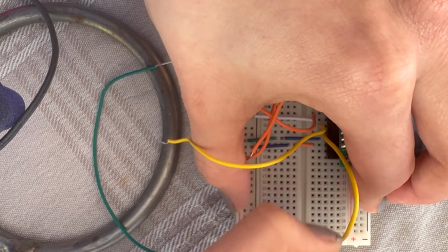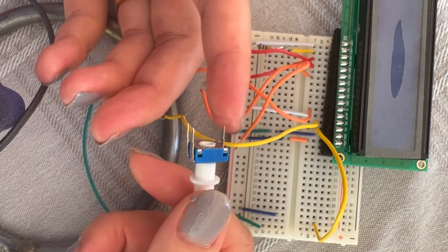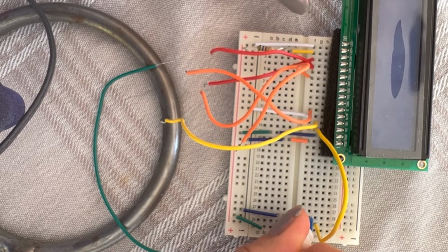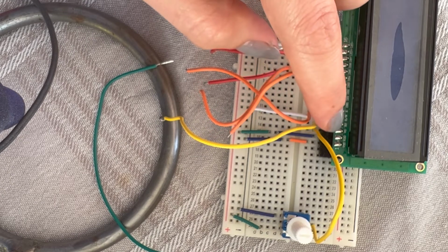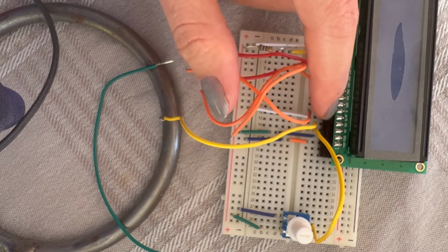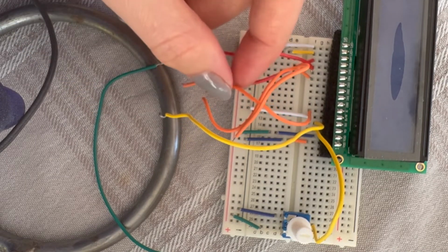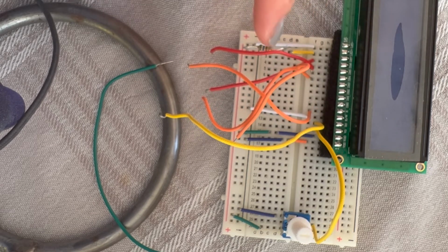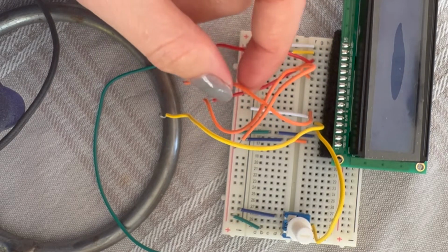Let me show this. It has 3 legs, as all other sensors. These 2 legs, either of them, you connect to plus and negative, I mean ground and plus, and then the third leg is connected to the one which says V0, the third pin on the LCD. The fourth one, which is RS, will be connected to pin 12. After RS there is R/W, the fifth one, which is also connected to the ground. The sixth one, which is enable, called E here, will be connected to 11.